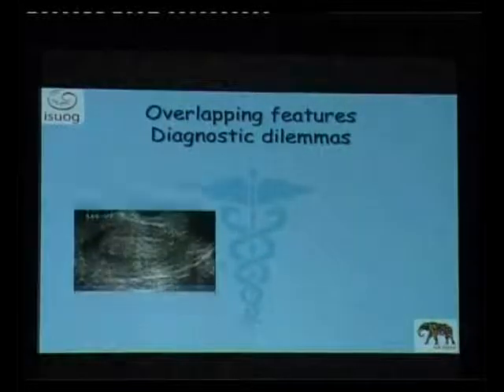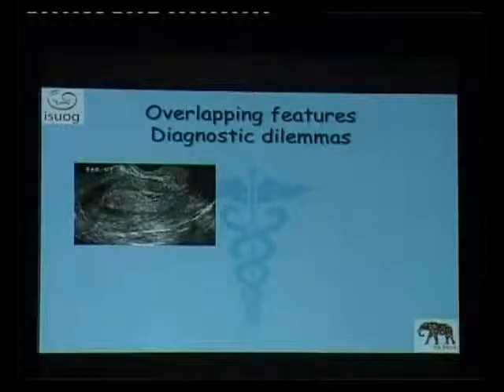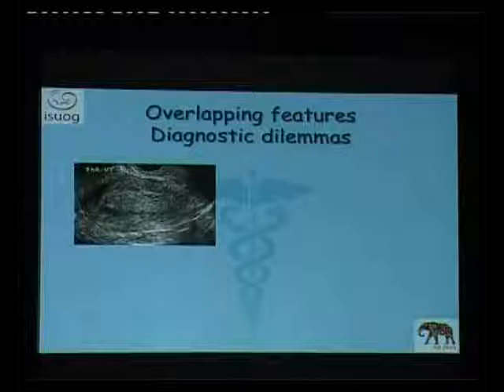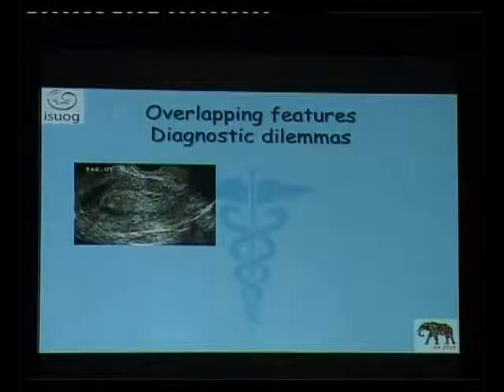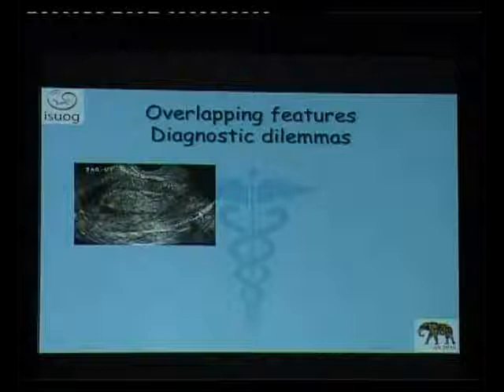Similarly, another patient came to me, only about 49 years old, with no bleeding, but she was having some secretions. The transvaginal scan showed definitely increased thickness. The only point bothering me was a hypoechoic area seen at the periphery, which we felt could be some fluid, and then we had a doubt whether it was a polyp.